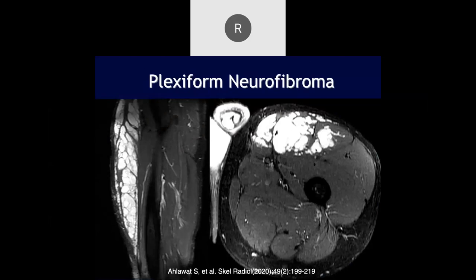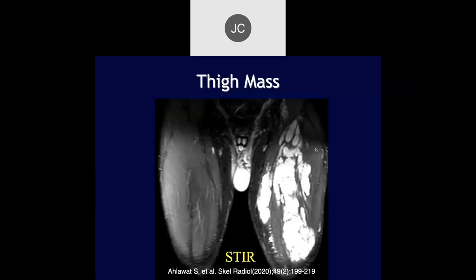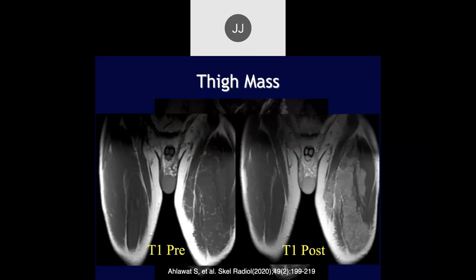So this was a plexiform neurofibroma. They can look very inhomogeneous. They can be large, almost look very infiltrative. Fortunately, most of the neurofibromas that I've seen have been more discrete than this, with multiple masses, often in a grape-like structure along a nerve, or just isolated. But the plexiform type can be much more infiltrative in its appearance, extending through the nerves that go into the muscles. Lesions like that is why I don't like oncologic surgery. Yeah, right.